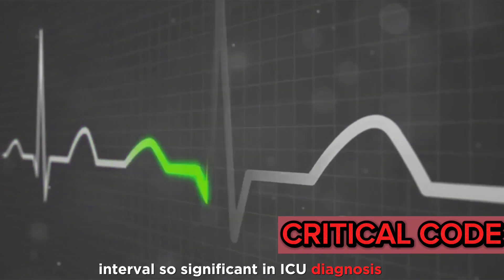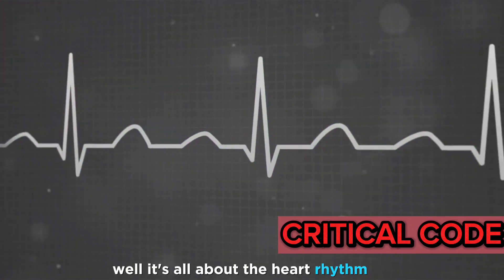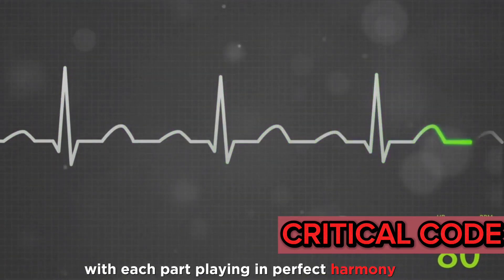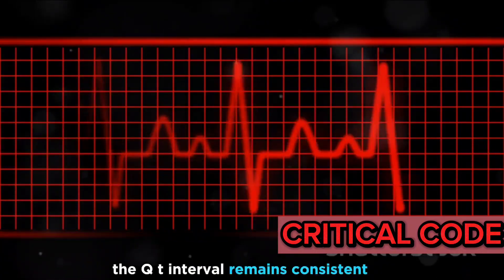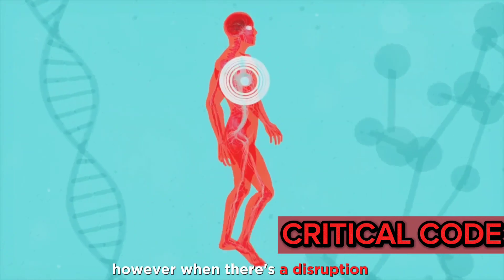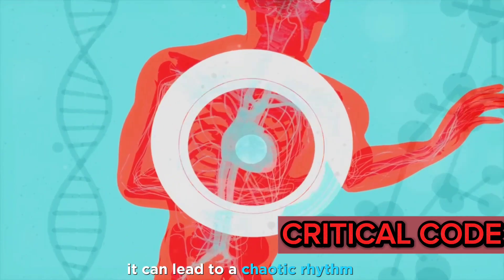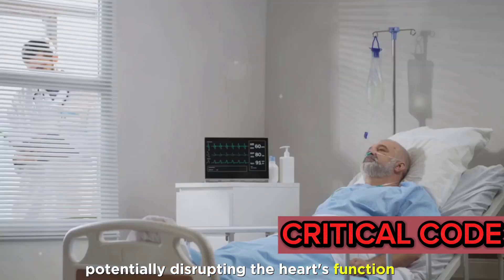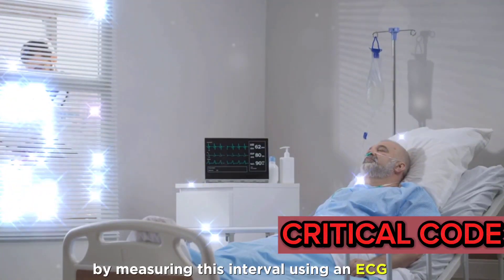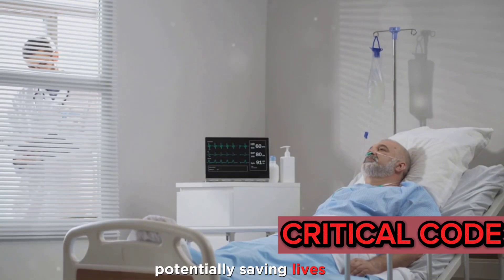What makes the QT interval so significant in ICU diagnosis? It's all about the heart rhythm. The heart is like a well-tuned orchestra with each part playing in perfect harmony. When all goes well, the QT interval remains consistent, allowing the heart to function efficiently. However, when there's a disruption — akin to a musician playing out of tune — it can lead to a chaotic rhythm, potentially disrupting the heart's function. By measuring this interval using an ECG, we can detect these disruptions early, potentially saving lives.